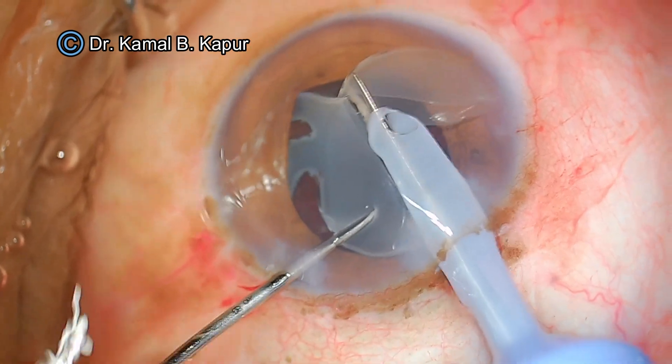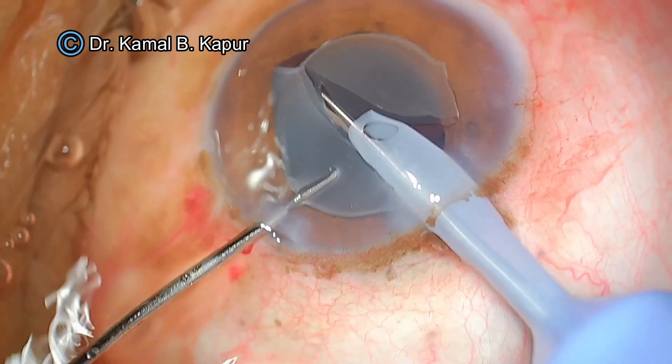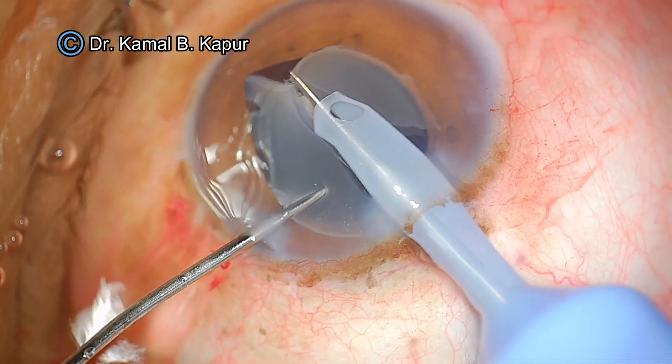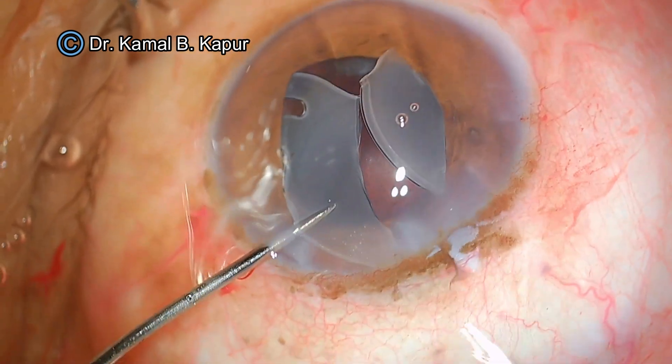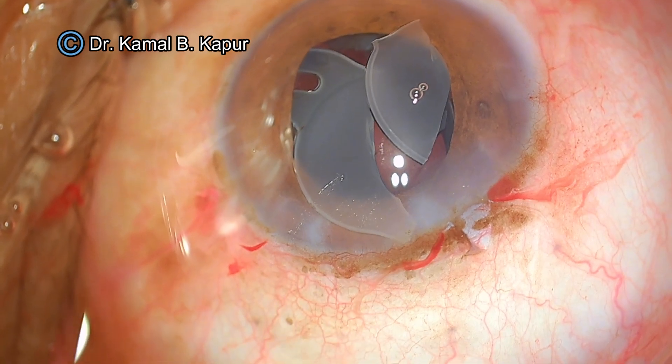You need to be very careful when doing this step. You can hit the endothelium near the angles because that is where the cornea is sloping downwards. When you go into this zone you can actually hit the endothelium, the posterior capsule, or the iris.